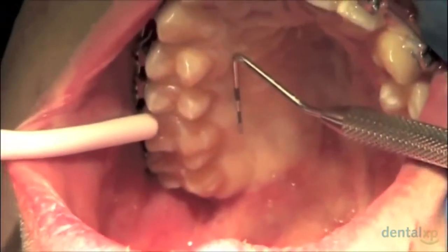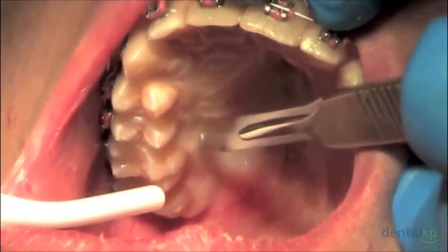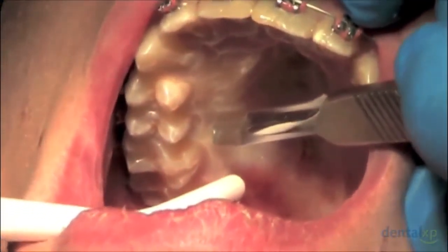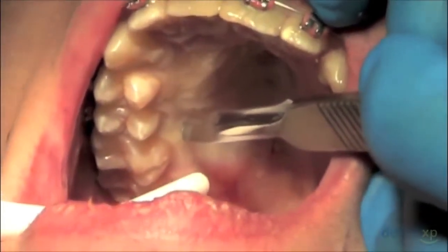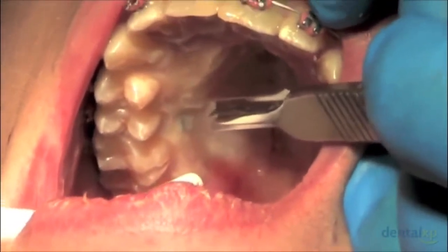At this point, all I'm doing is simply measuring the mesial distal widths of the lower incisors and transferring that distance over to the right side of the palate. From here, we'll roughly be able to determine how large to make both the donor and recipient sites.